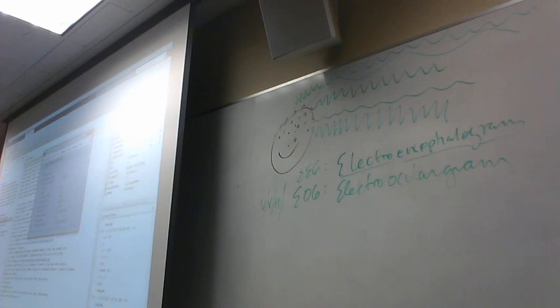Hertz. Like the rental car? Yeah? Okay. So, we start from 0. Let's say we bump it up to 100. Roughly 50. We mentioned 60 hertz line noise.